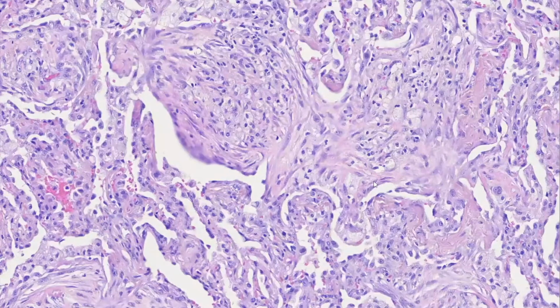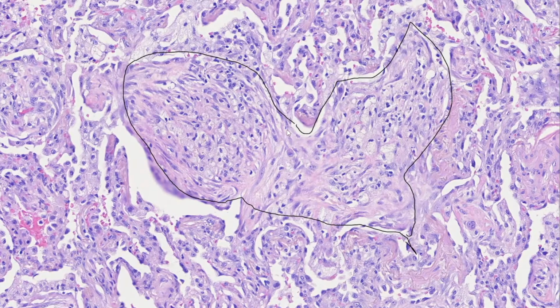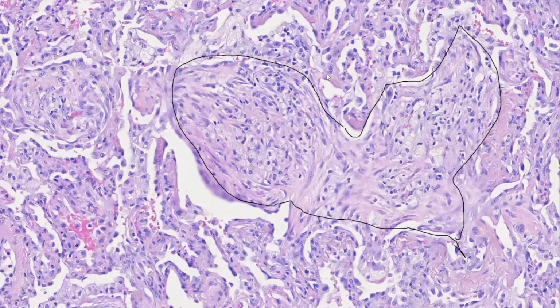So if I just move it like this, you can kind of see that it has this almost dumbbell-shaped appearance. And then it kind of expands out here, expands out here. And so we often describe these polypoid areas of loose fibroblastic proliferation that have a mucopolysaccharide-rich nature to them. And then in the interstitium, you do see some admixed inflammatory cell infiltrate as well. So this is a case of an organizing pneumonia.